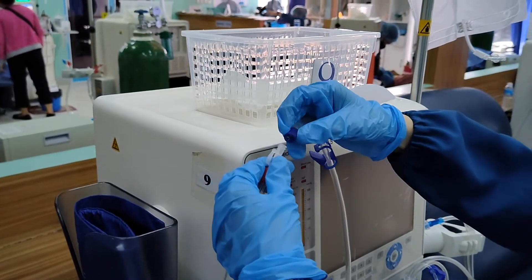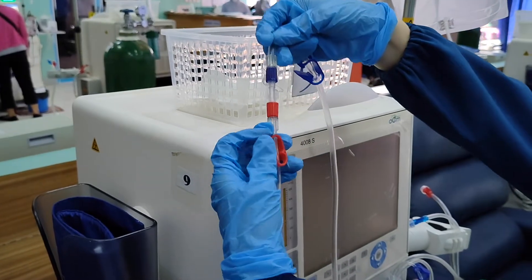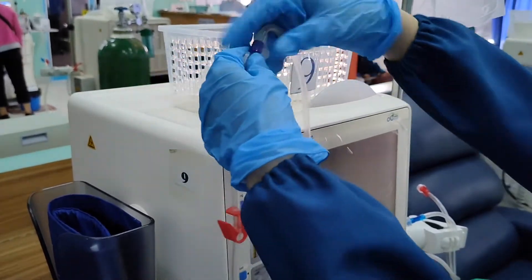Then, connect the venous end to the arterial end together. Then, temporarily set aside.